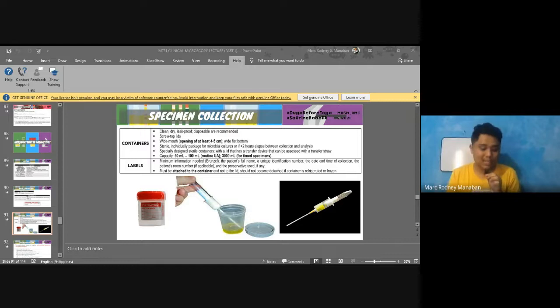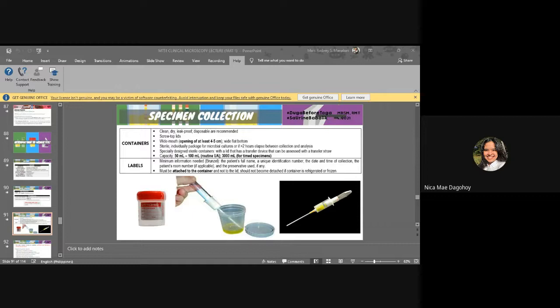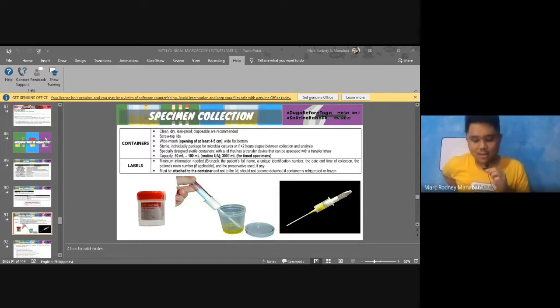May tawag yun sa inyong hospital assignment. Ikaw jud mismo naka-assign sa CM. Nakadawat kang ihi. Yan ay culture and urinalysis na request for the same sample. Usara gyud. So what should you do? Culture, sir. Culture unahon. Alright. Si Lujay kay urinalysis. Okay. And so may ato ang buhaton. Sige. As an intern.